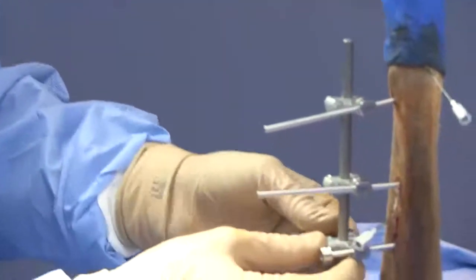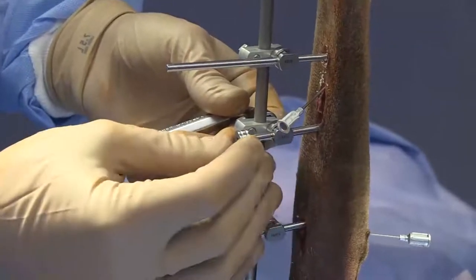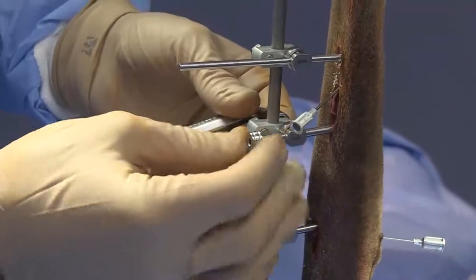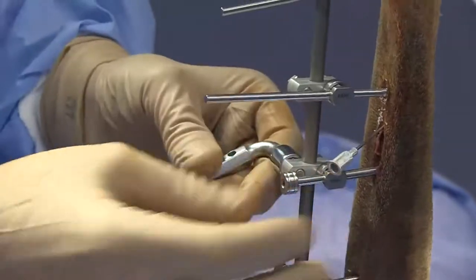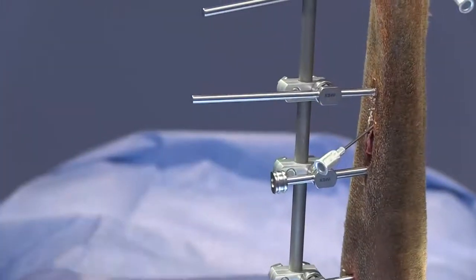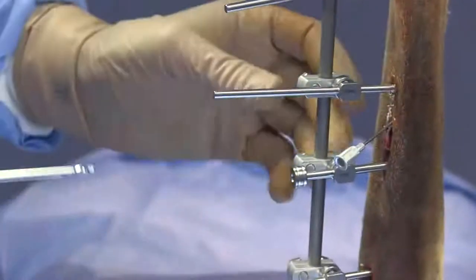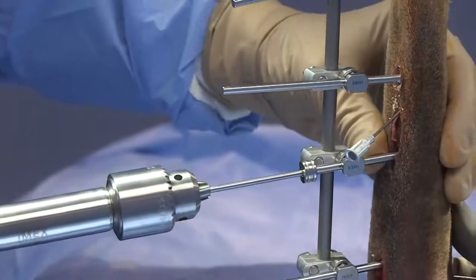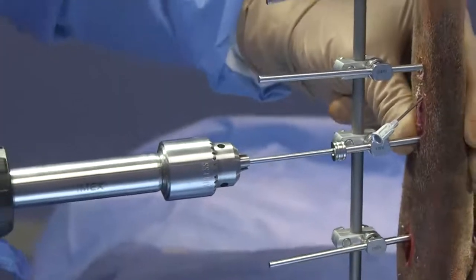That's the secondary bolt you're tightening. If you were to tighten the primary bolt instead, what that'll do is apply compression at that hole and actually crush the drill sleeve — you certainly don't want that. So no need to tighten the primary bolt much — that could be just finger-tight. Apply the tightening only to that secondary bolt. Then get your drill, place it into the drill sleeve — which is right up against the bone — make sure you're happy with your alignment, and go ahead and drill.